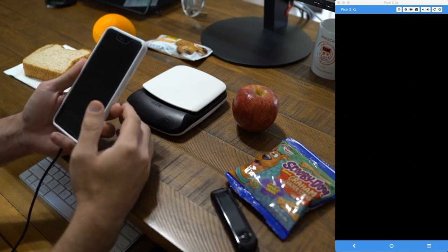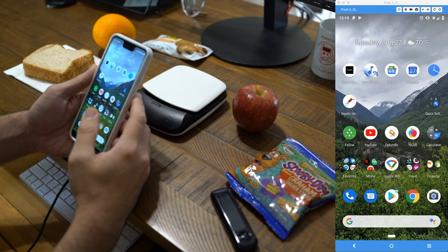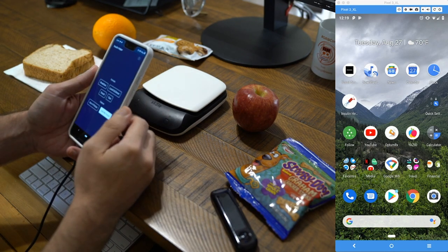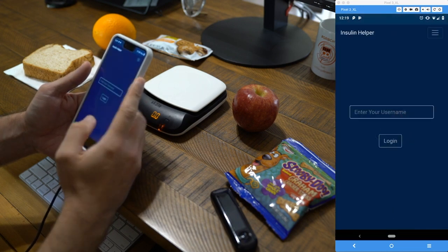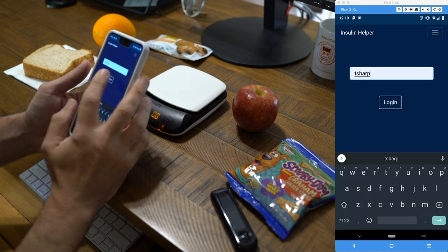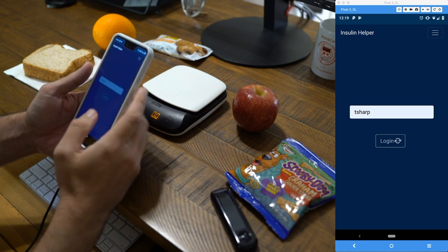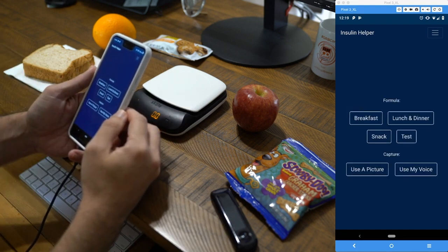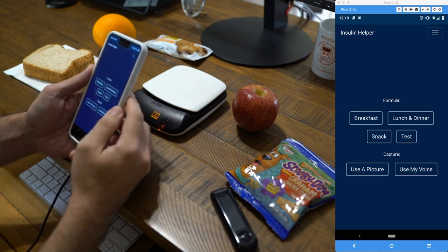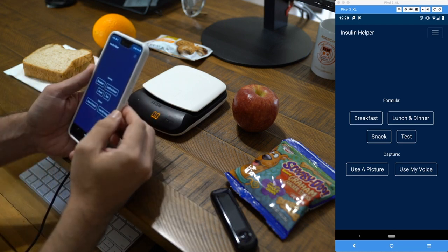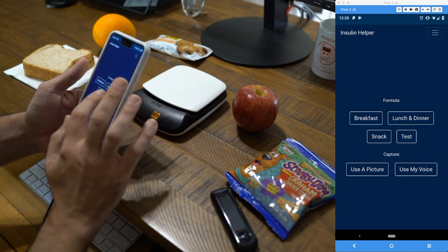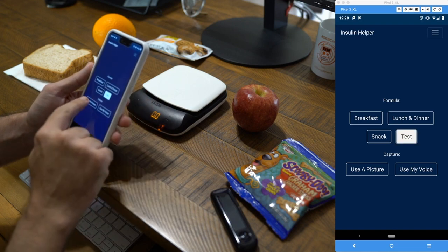I've created this application called Insulin Helper, and I'd like to show you how it works. You launch the application, select your username, and log in. Once logged in, you get a list of all the formulas you've created. You can create different formulas for different times of day, different meals — snacks sometimes don't require blood glucose coverage. You can accommodate all those scenarios and capture the food you're going to eat either using a picture or your voice.